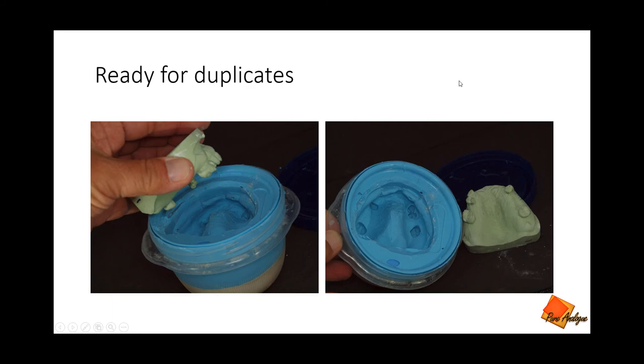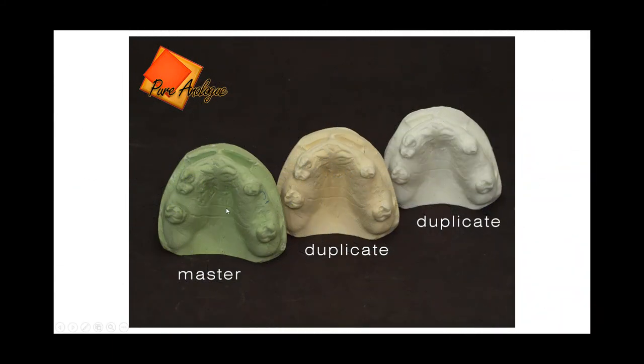Once you've removed that, you can mix up any stone of your preference and pour a duplicate. Here I poured up a resin model from some duplicating resin that I also pick up from SmoothOn Corporation. But the point is that it's identical and inexpensive.